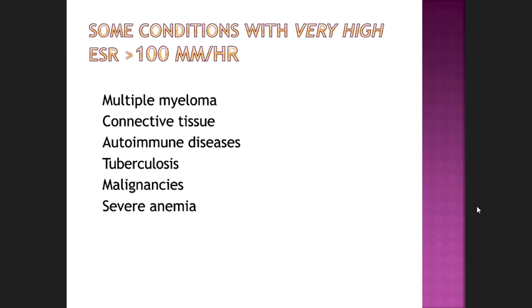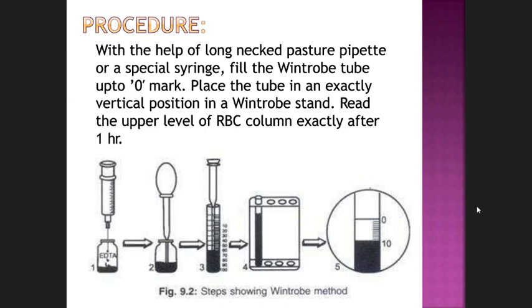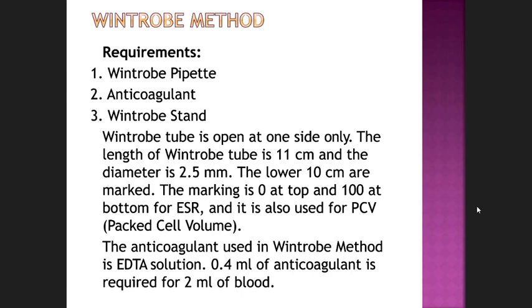Excuse me, yeah, Dr. Manish. I think you should explain the procedure, student. Both the Wintrobe method and the Westergren method, you explain first of all of them. Sometimes the examiners ask. First of all explain them, then ask questions about them. The procedure. Okay? Explain them.